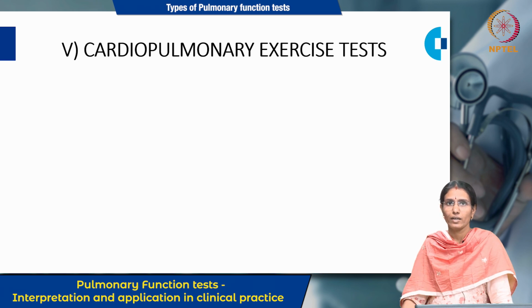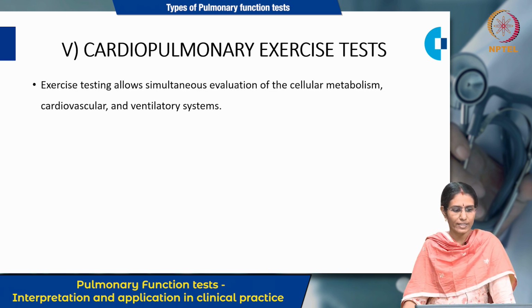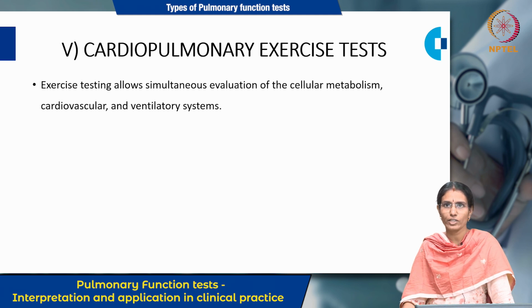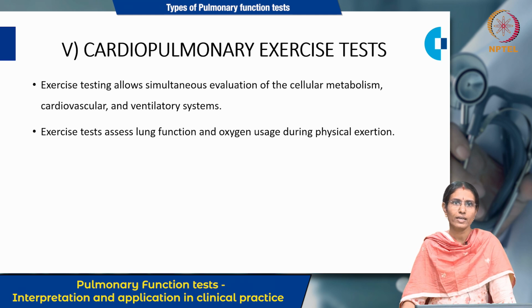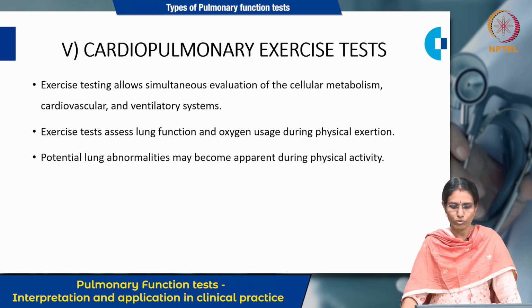And then let's see the cardiopulmonary exercise test. Exercise testing allows simultaneous evaluation of the cellular metabolism, cardiovascular and ventilatory systems. Exercise tests assess lung functions and oxygen usage during physical exertion. Any potential lung abnormalities become apparent during the physical activity.